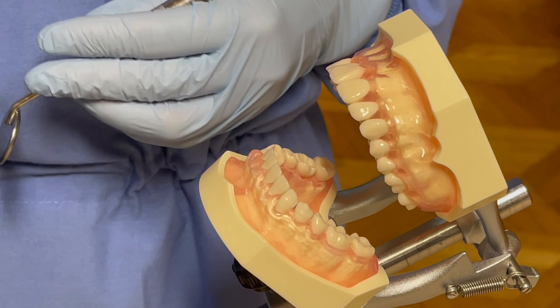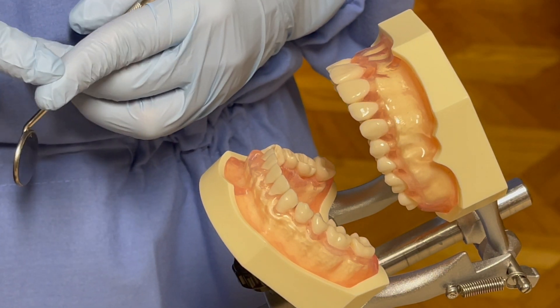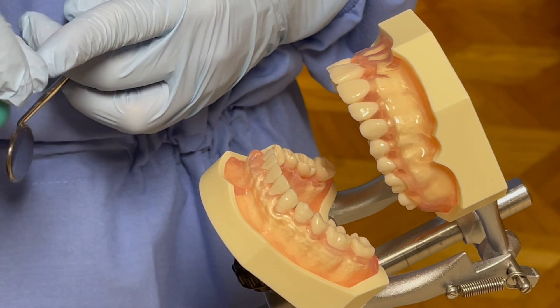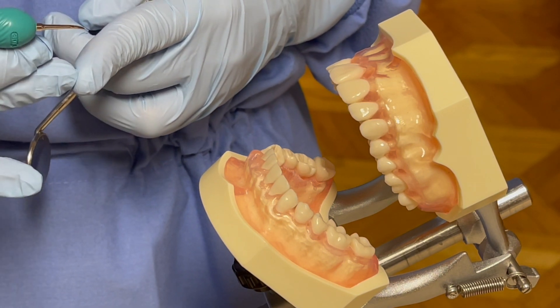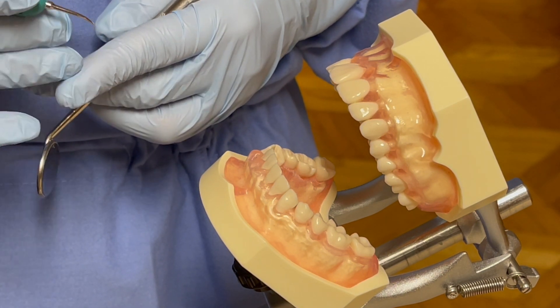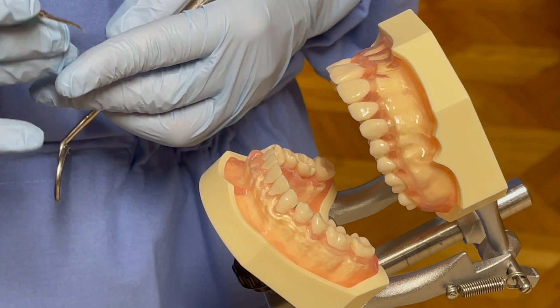Hi Mr. Typodon, I'm going to demonstrate ultrasonic scaler technique to my instructor. An ultrasonic scaler is a pen-like instrument with a blunt tip which is used to remove plaque, calculus, and stains, as well as flush out debris, bacteria, blood, and toxins during the procedure.